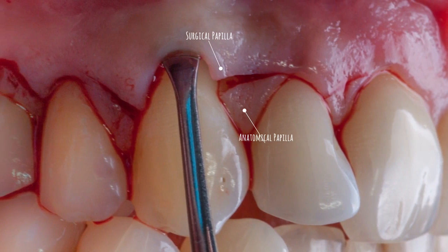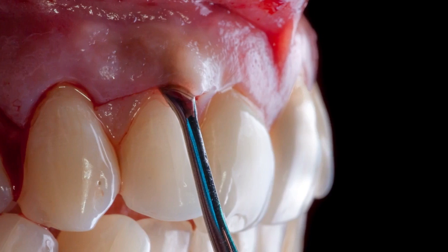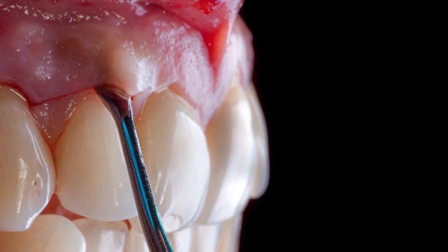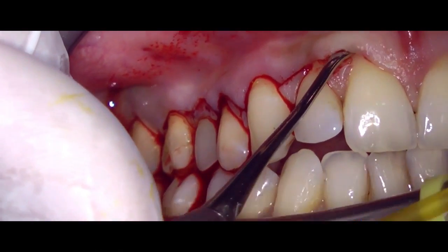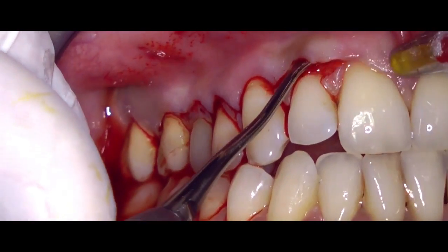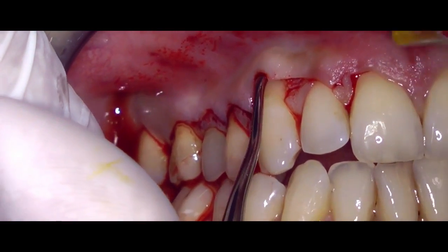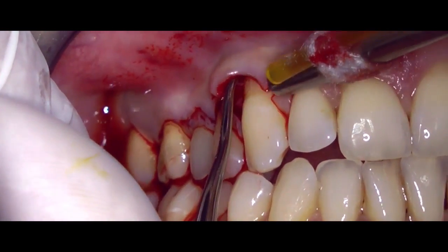Now we start to reflect the tissue using a small instrument, and this time we will go full thickness, making sure that we expose roughly 3 mm of bone apical to the bony defect. The idea here is to keep an adequate tissue volume and also to allow for a portion of periosteum to cover the root.